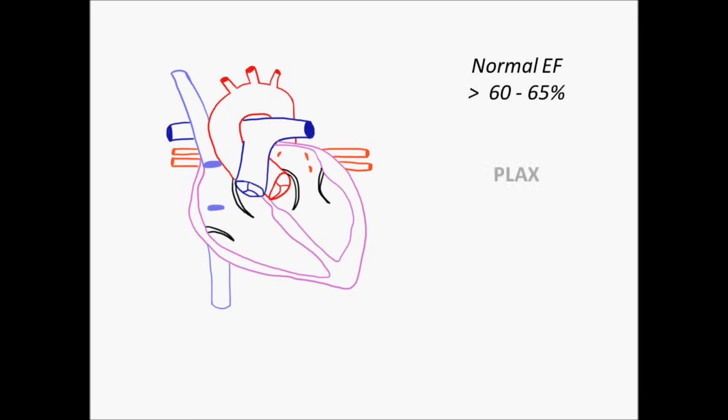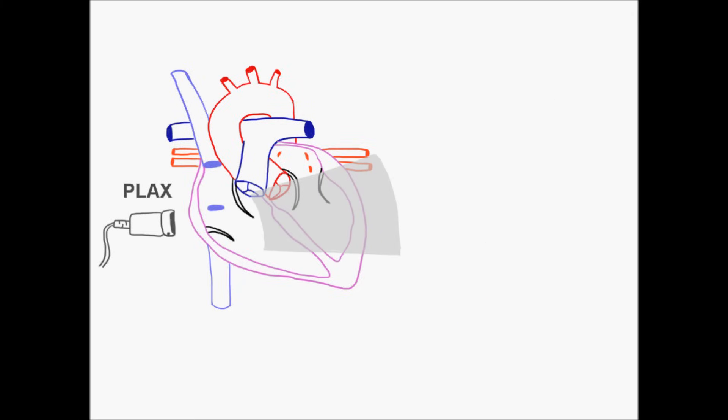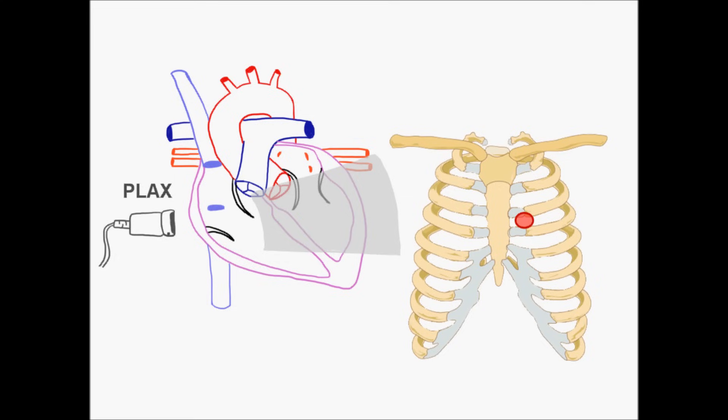We should use three views for the visual assessment method: the parasternal long axis, the parasternal short axis, and the apical four-chamber view. Going over these in detail is beyond the scope of this presentation, but the Sonosim site is a great resource for learning how to perform them. Let's take a look at the normal heart in a parasternal long axis view.